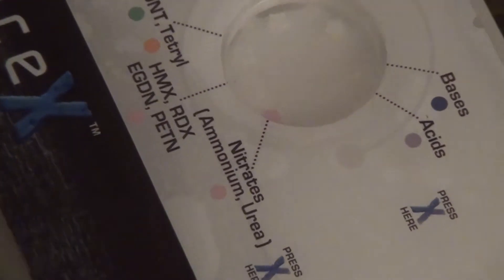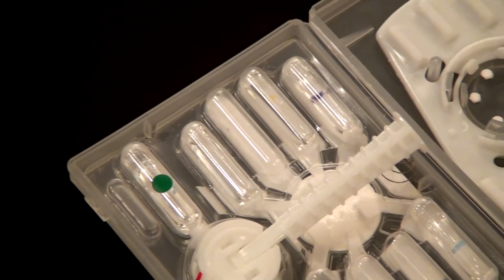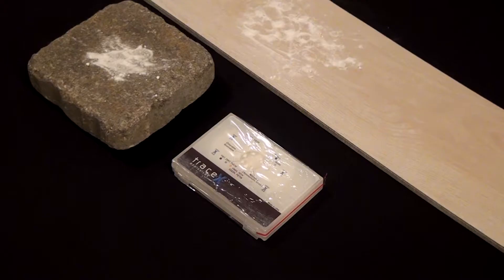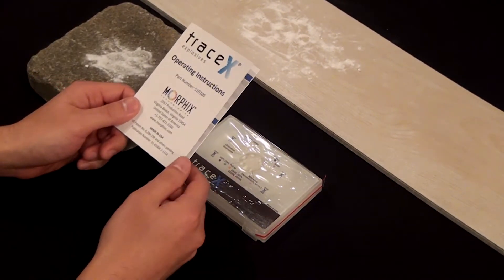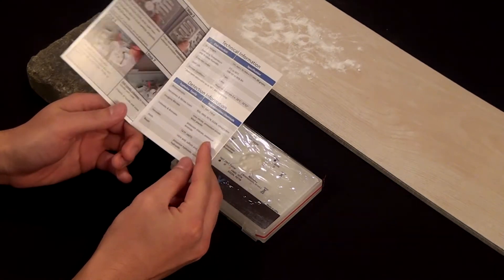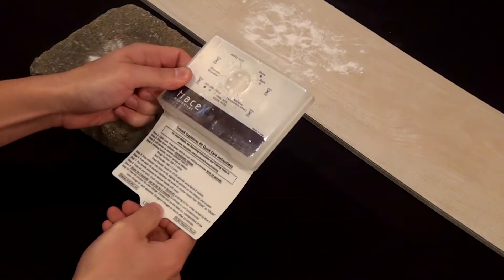The TRACE-X Explosives Kit is designed for the real world. The TRACE-X kit includes a rugged case that contains everything required to test for nine HME or precursor families. Inside the kit, you will find the collector with its handle, the self-contained testing ampules, and the crusher on the inside of the lid. Results of the test will be shown in the kit window. These same 10 steps are described in the operating instructions provided with each box, and are also summarized in a quick card attached to each kit for easy reference.